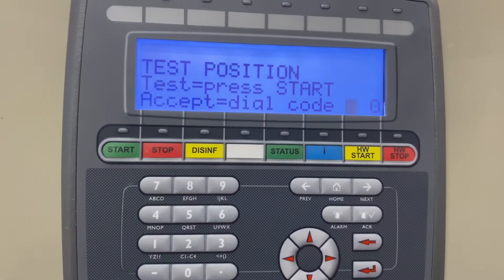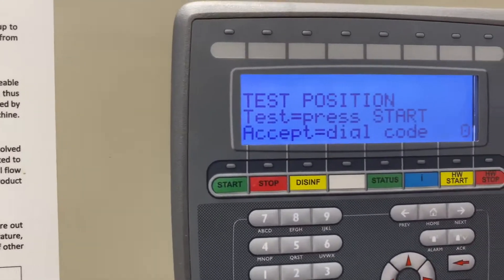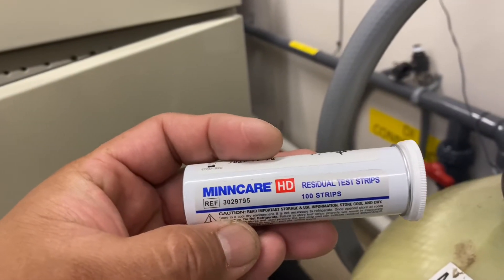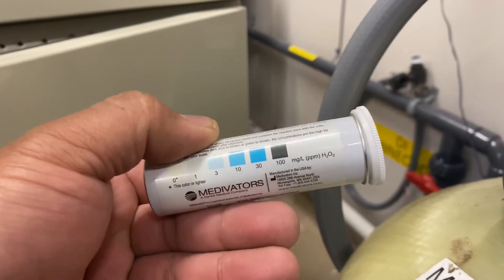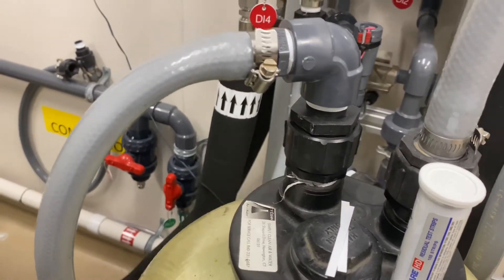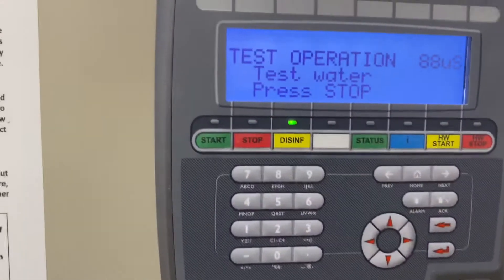We need to check if it's negative on the drain — I'll show you later. Press start for the test. What it does is give time to check the water for negative. We're using the Minncare residual test strips. Pull out some test strips. It's rinsing right now.